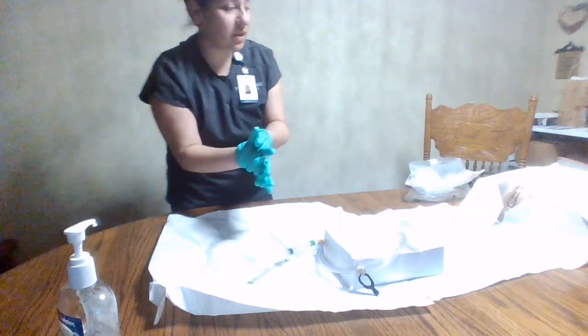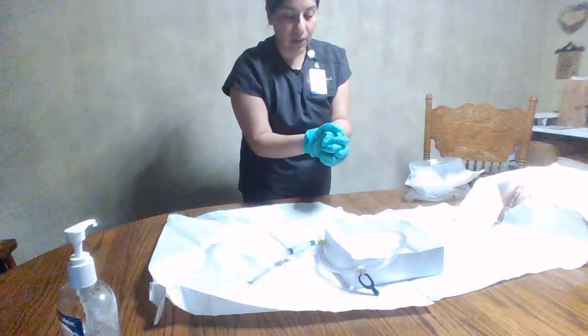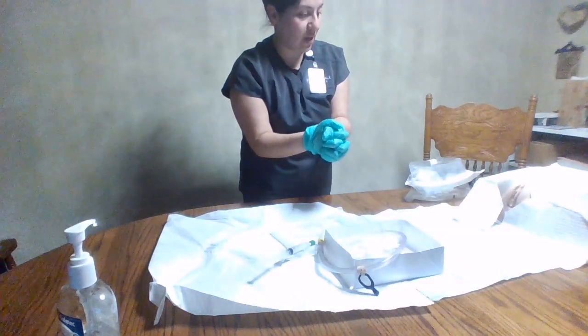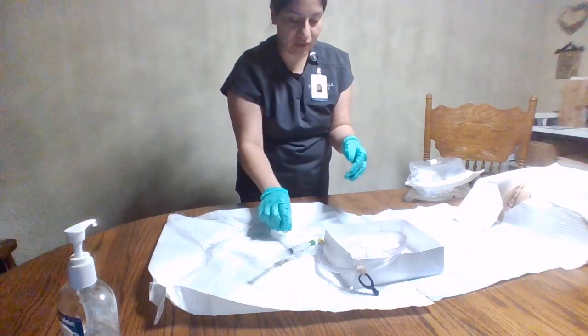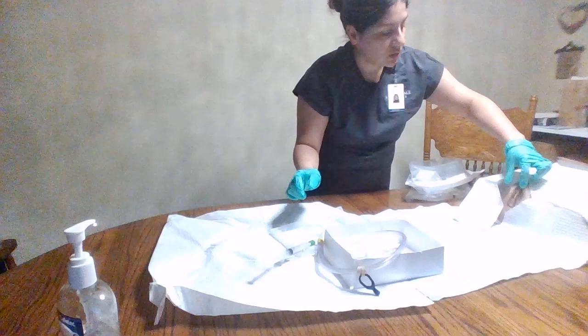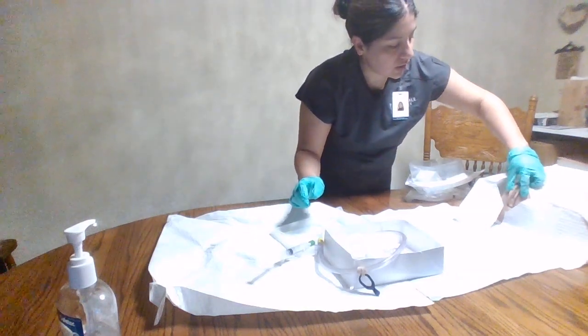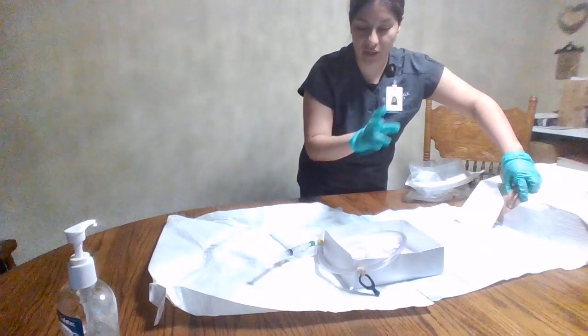All right, Mrs. Smith, I have gone ahead and set up for the Foley catheter. I am going to go ahead and begin with cleansing you again. Is it okay if I go ahead and touch you? Okay, perfect. So we'll go ahead and begin. Once I have touched the patient, this hand is now considered dirty.